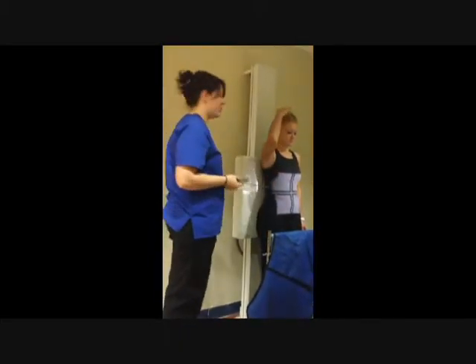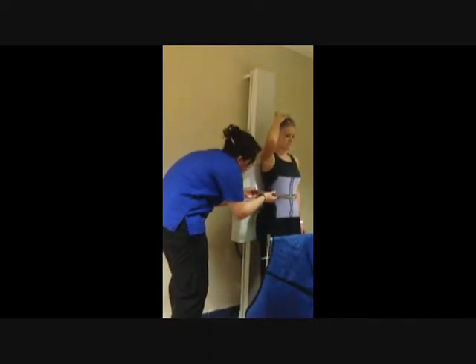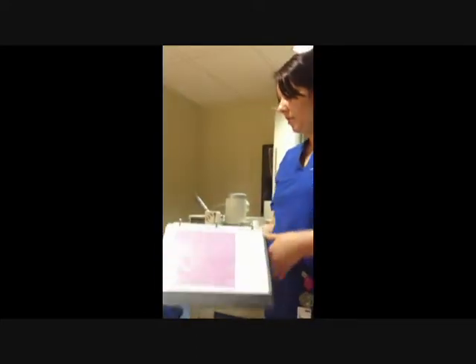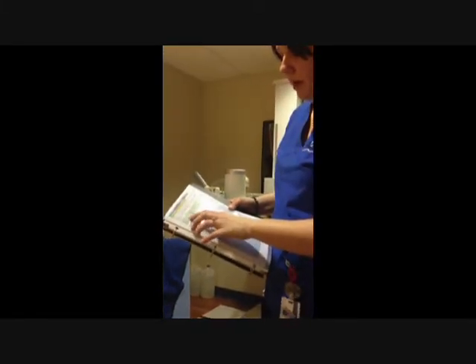And we're going to take our calipers and measure our patient so that we can find our exposure factors. She measures 21. When you look at your exposure factors, you want to make sure on your table or on your board that you have the upright, the wall bucky selected. And you want to make sure that all three chambers of the AEC are selected. And in her category, we have KVP of 80 and a backup mass of 36.